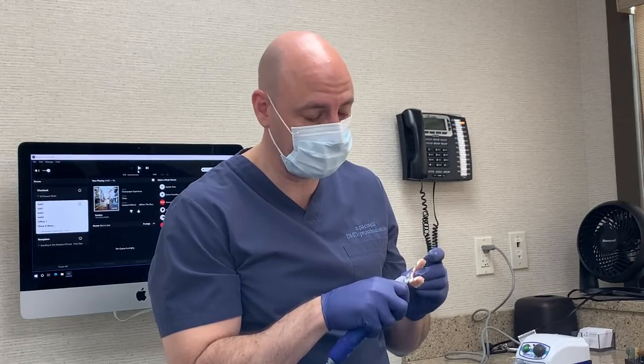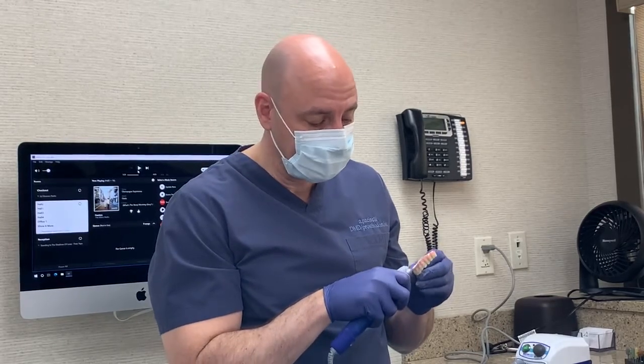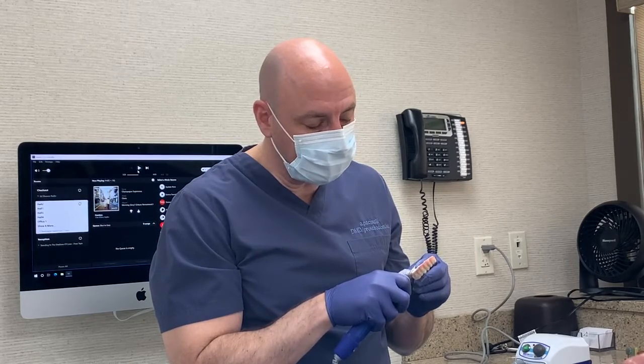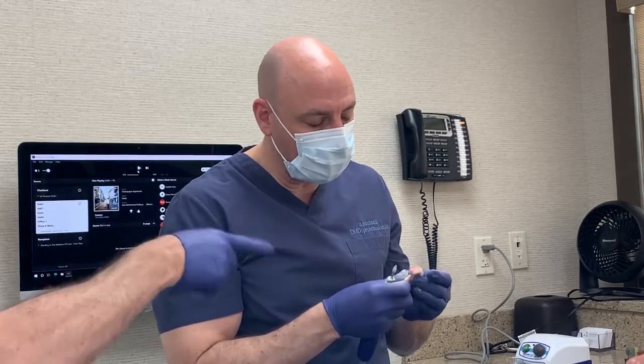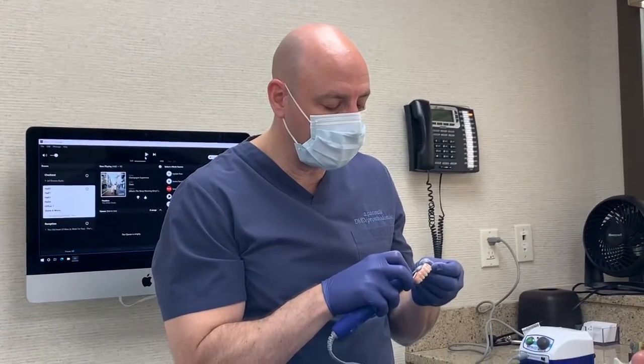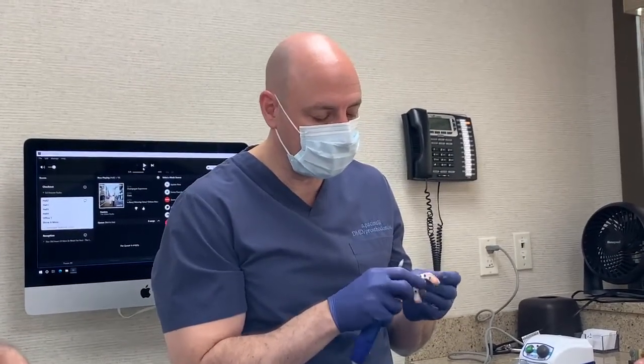Yeah, exactly. But a bruxer with lower bridge work, the zirconium against this you wouldn't do. The zirconium is going to wear this more than anything. It's putting light pressure on the tissue where a whole bunch of stuff's not going to accumulate, and they could use either a floss or a floss threader or something called a super floss underneath it to clean.